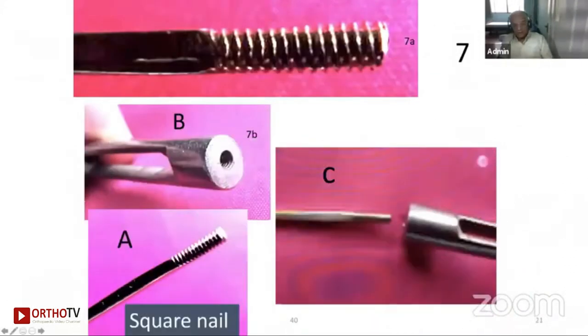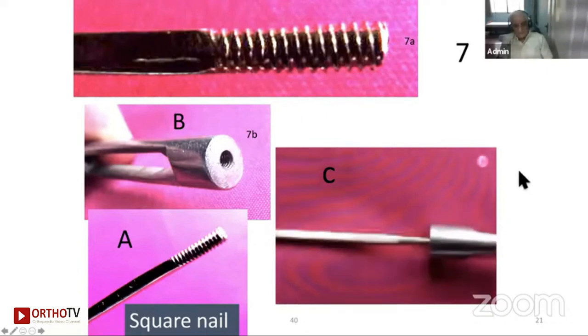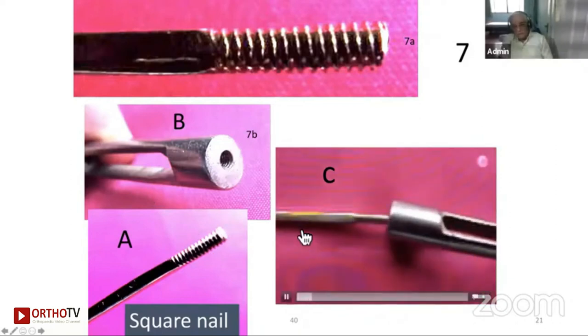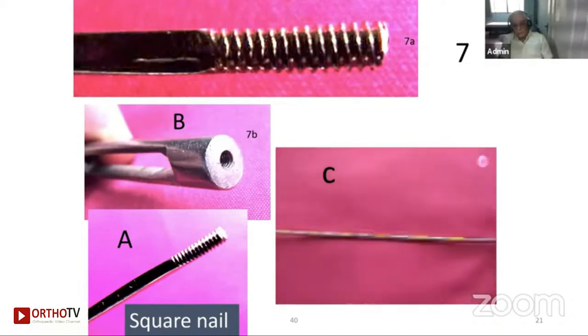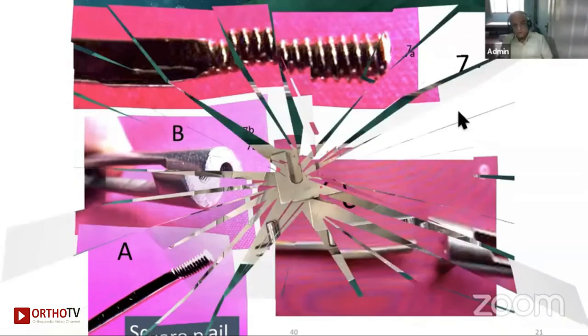Now here it is, some of you may not know it. This is the Talwarkar nail extractor. These threads go here, and as you can see, it will jam it here, and then you can take it out. In old times, we used to use this Talwarkar nail and this extractor, which is extremely useful to take it out.